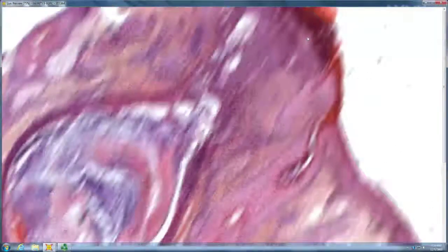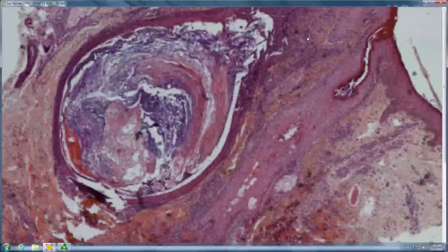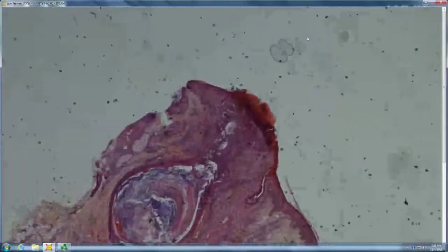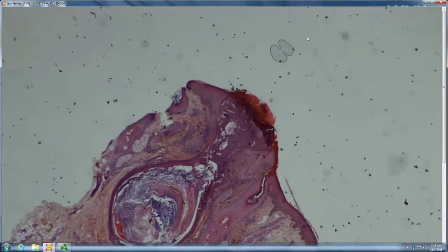Okay, so I see a hair follicle filled with like keratin debris. Yeah, so a big dilated hair follicle with suppurative inflammation. Yep, so what are we probably looking at? It looks like acne. A zit, right? So acne starts with follicular hyperkeratosis, retention of keratin, and then there's secondary overgrowth of bacteria and inflammation, but the primary pathogenesis is a retention hyperkeratosis, which is why retinoids are so key to the management.